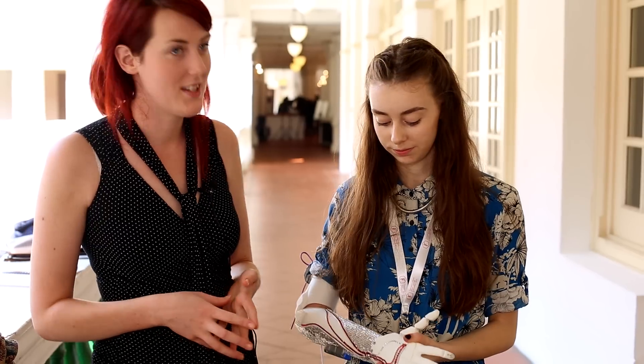This idea was put forward by OpenBionics — we're a Bristol start-up company. There's four of us and we work within the realms of robotics. We wanted to make low-cost bionic hands, and a really good way to do that was using 3D printing and other 3D technologies like 3D scanning and 3D modelling.